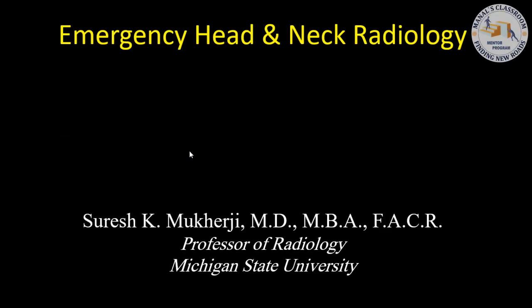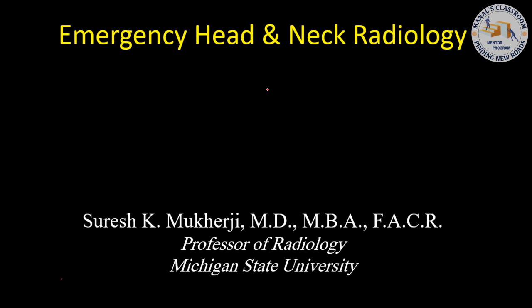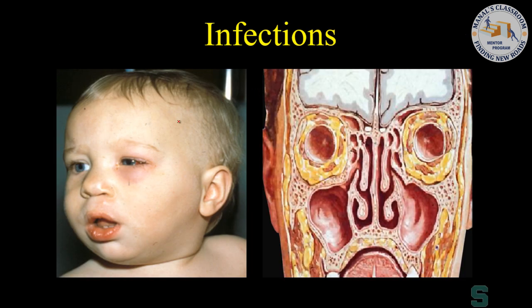So the next thing that I'm going to talk about is emergency head and neck radiology. Essentially what I want to focus on is head and neck radiology in the emergency room, and some things that you may see at night in an acute setting. The first thing that I'm going to talk about are infections involving the periorbital region.